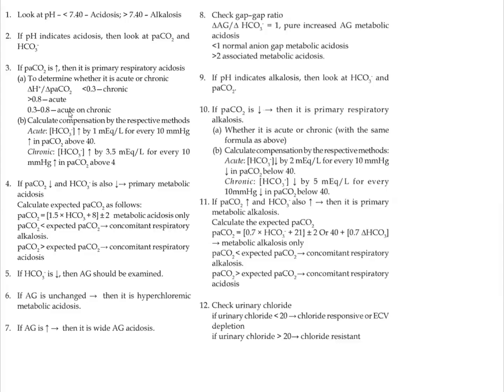Similarly, in case of respiratory alkalosis, you can use the same formula to know whether it is acute or chronic. This is only when you're in doubt. Otherwise, most of the questions will have a hint of whether it is acute or chronic.